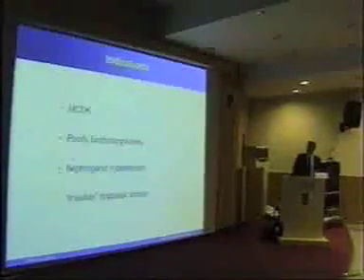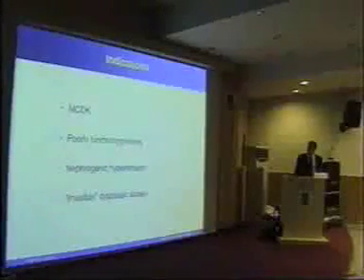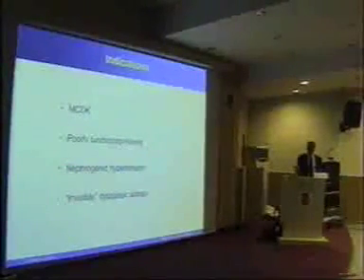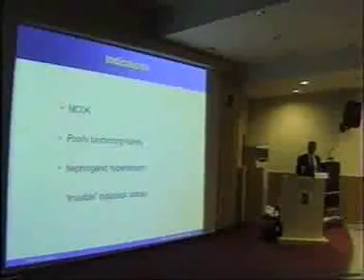Nephrectomy. Now, I said this is the next level, and there are various indications for nephrectomy. These are the absolute indications for nephrectomy, and any kidney fitting in these categories, I would always remove laparoscopically without any doubt, unless the patient had had previous abdominal surgery.